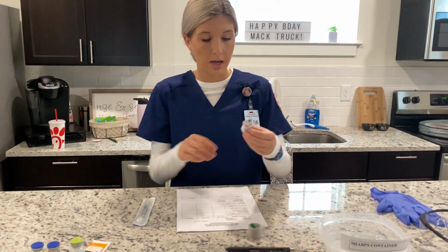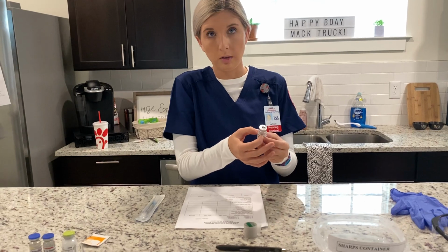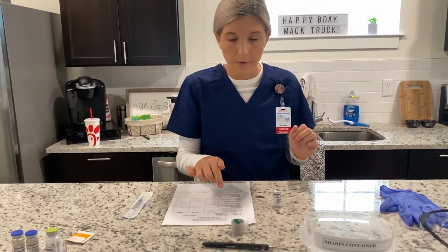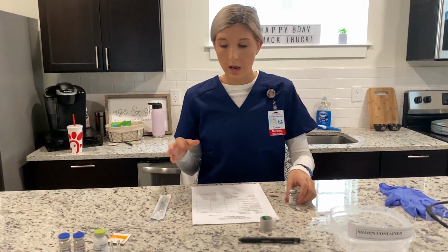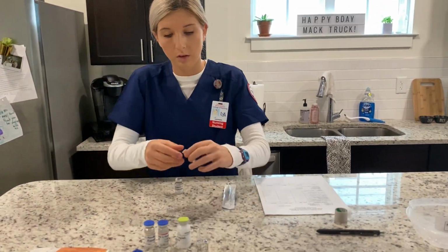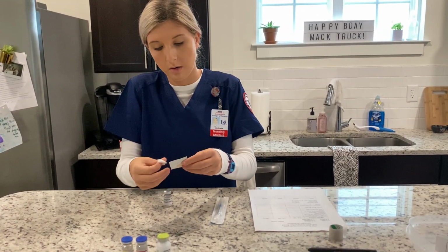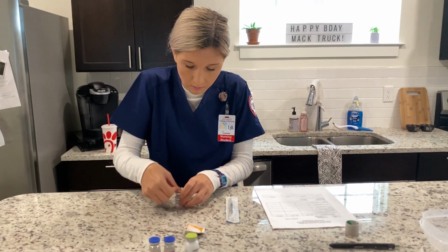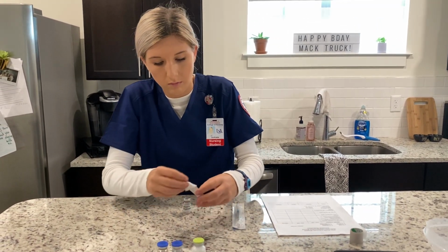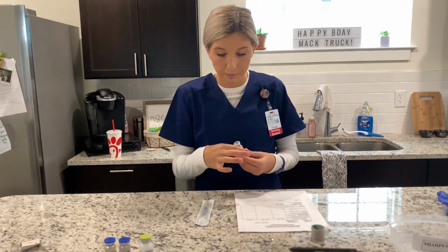So I see that it is heparin, 10,000 units per milliliter. So since the dose is 5,000 units, I would do 0.5 milliliters in the syringe. And then I'm going to clean the vial with an alcohol-based prep.